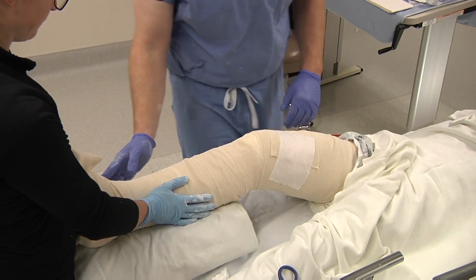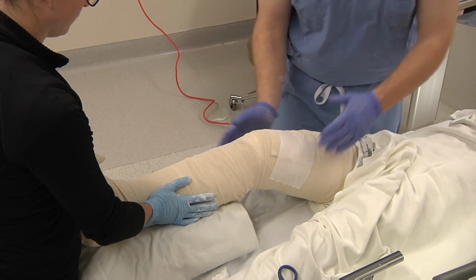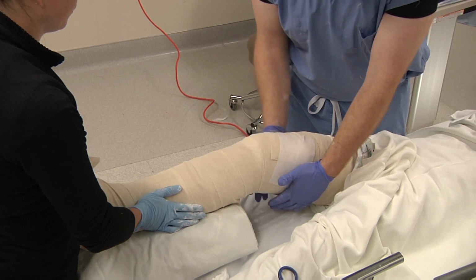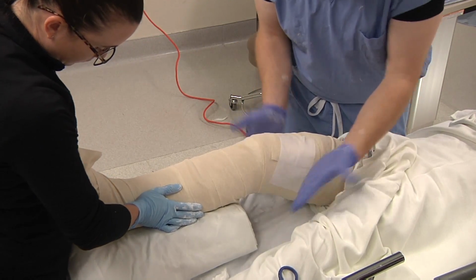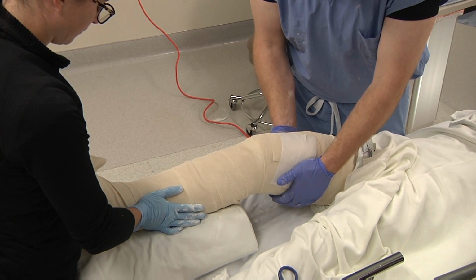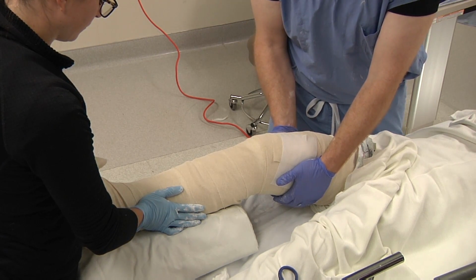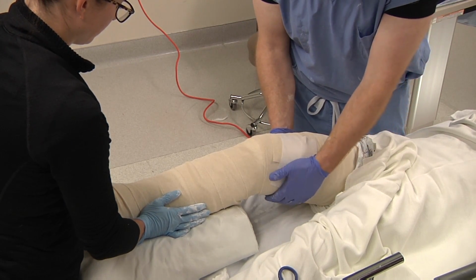You're doing your Quigley's reduction, if that needs to be with an ankle fracture or you're pulling out to length. It's also beneficial in this upper section to apply a supracondylar mold so that the splint does not slip down the leg. That's just broad surfaces of the hands applying pressure to the splint about the thigh. At this point, it's really important to hold the plaster until it's hard, until it's knock hard, and it's not easily depressible with a finger.